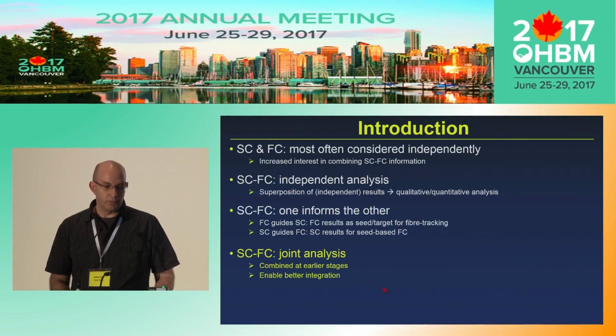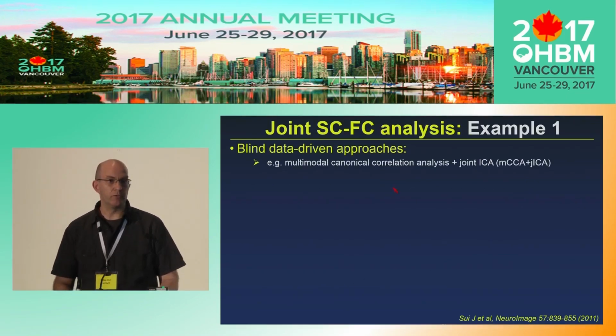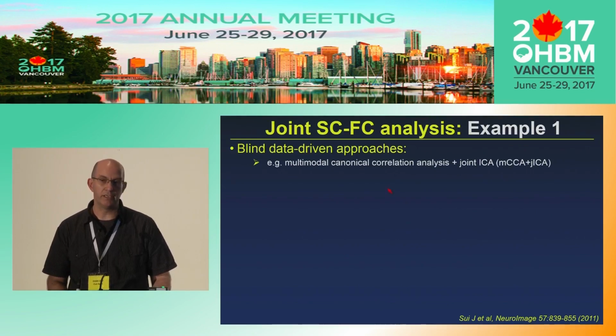What I'm going to focus on for the remainder of the talk are the approaches where you actually do the analysis jointly, combining at the very earliest stage of the analysis, and in some way trying to integrate the information so that it is better, or more comprehensive. One of these types of approaches is using blind data-driven approaches, and it's been pushed, for example, by the group of Vince Calhoun. They're doing quite a lot of work on this.